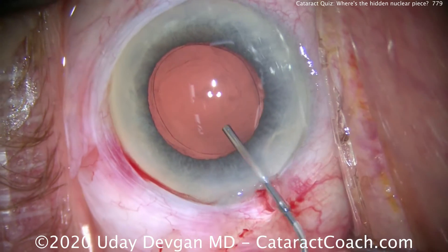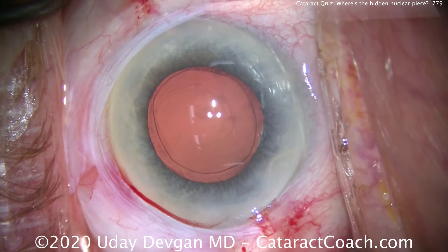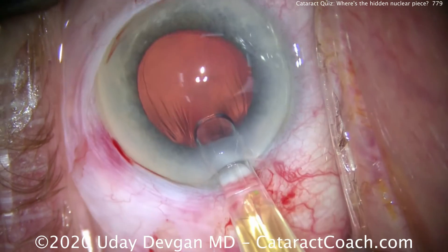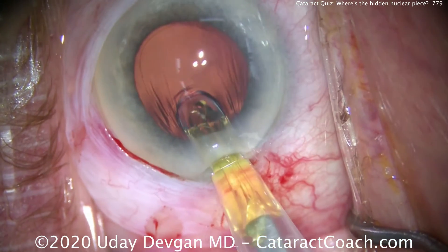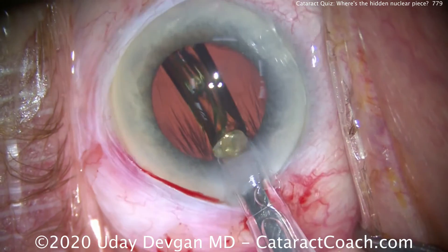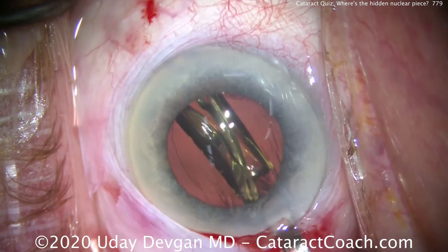Now let's fill the capsular bag with the cohesive viscoelastic. We're showing the video in real time now. Here comes the lens — a single-piece acrylic lens — inserting it in the eye nice and easy, delivering it into the capsular bag. That looks pretty good.